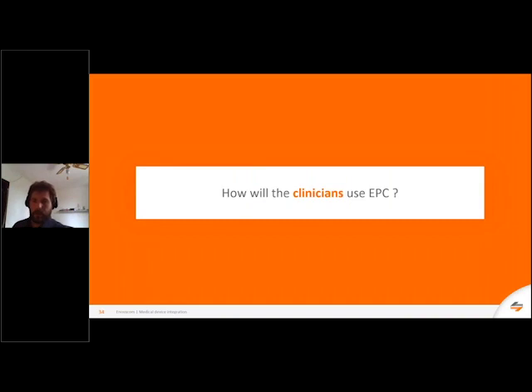So let's focus on Sarah's action to activate automatic data collection to Enovacom Patient Connect. For a patient, Sarah needs to access the patient record in the EHR. From this point, there are two possibilities: an integration with the EHR, as previously seen, or without connection, Sarah will just have to connect inside Patient Connect. And in those two cases, she arrives at the association window right here.